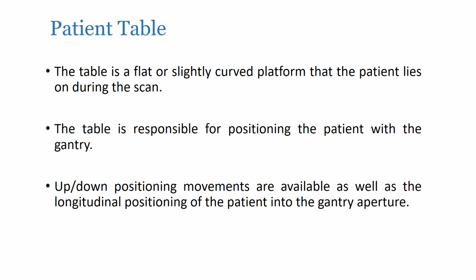So, this table is responsible for the positioning of the patient, so that the patient may enter into the gantry. This patient table has certain functions: you can move the table up and down, forward, and backward. You can control the patient table with the control panel.